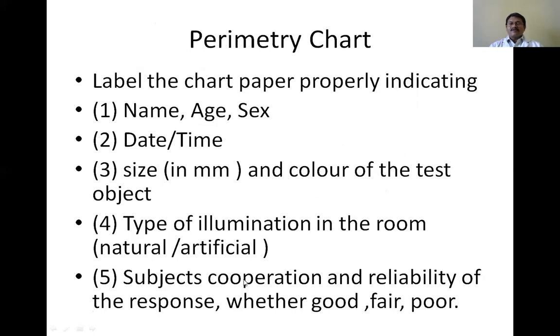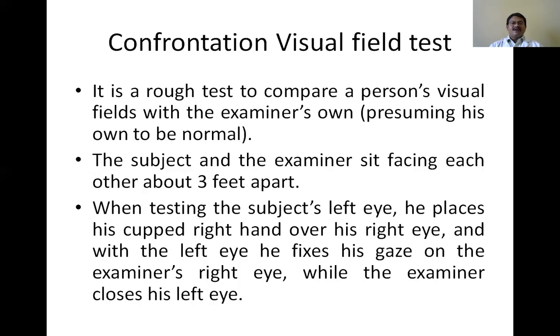If it is a non-cooperative patient, even in static perimetry, if the reliability parameters like the fixation losses, false positives or false negatives are not proper, you may be required to repeat the whole field.